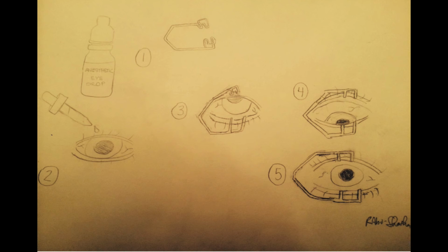Once this is secure in place, I tell the patient to return back into neutral position, and now the speculum is 100% in place, and in comparison to step number 2, we now have a full view of the globe.